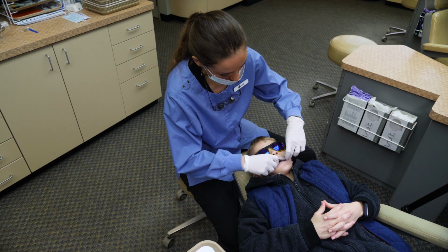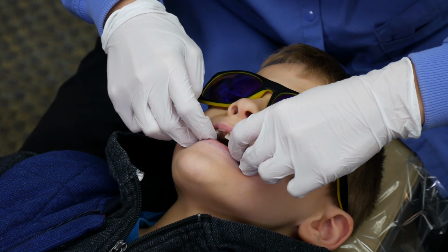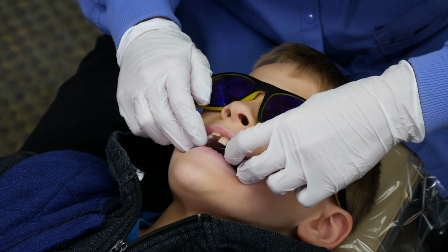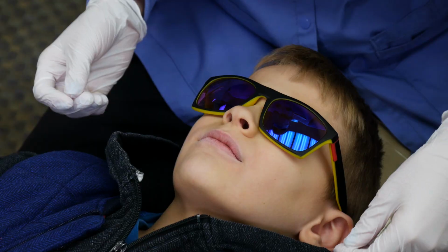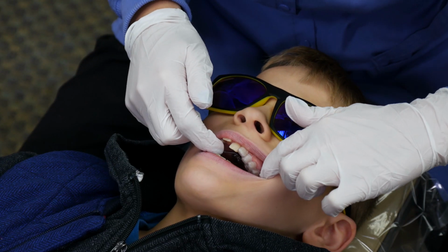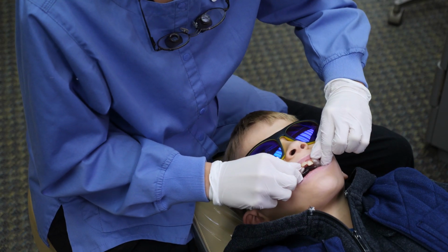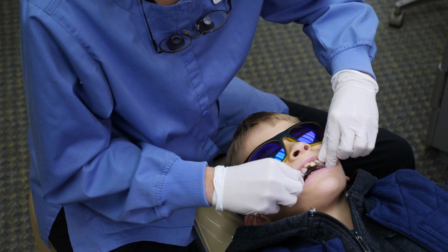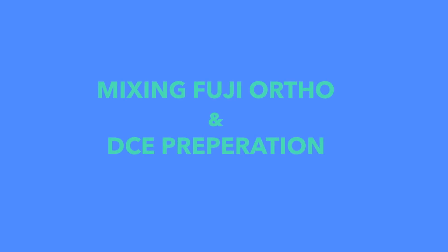The placement of the DeLuke contoured expander begins with the try-in. The try-in is so that the assistant can confirm the fit is proper. When the assistant tries it in, she has to visibly confirm there's no airspace underneath the plastic covering the teeth. Additionally, the plastic must cover all the enamel and be extended fully to the gum line.